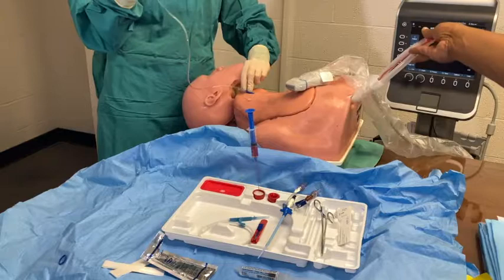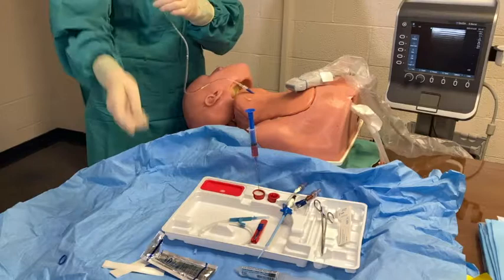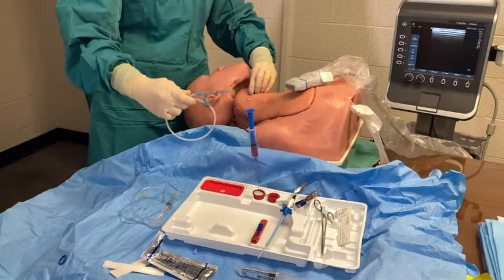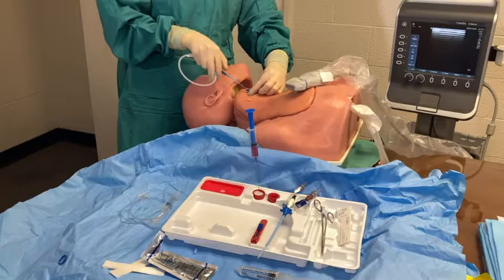Unfortunately, our model did not allow for blood to fill our manometry tubing. Remove the 5cc syringe and watch the column of blood fall down to confirm placement in the internal jugular. Next, you will thread your wire to about 30 cm.